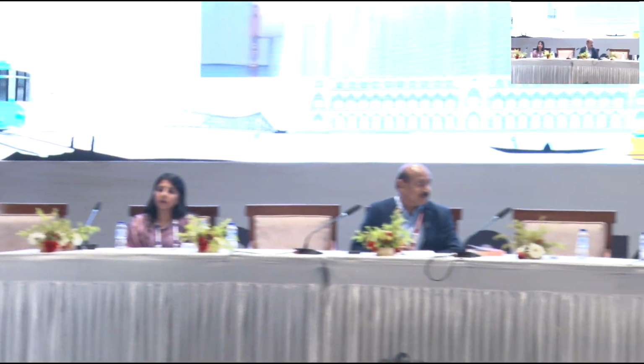Excellent presentation, Dr. Mudit. For the youngsters who would like to understand more about endoscopic vitrectomy, would you just explain how a person who is about to learn endoscopy manages the dimensions of the endoscope so that he doesn't see upside down?